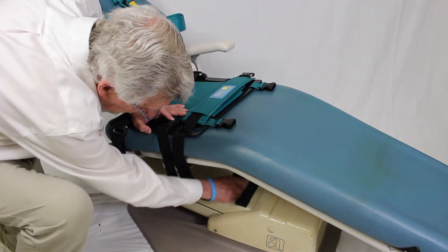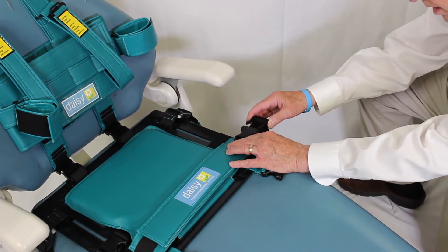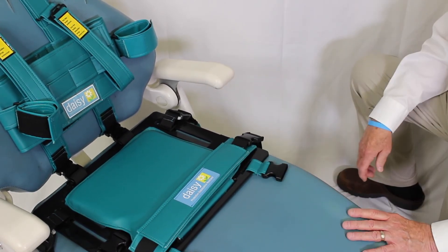Then thread the thigh strap under the dental chair to the original side. Attach this strap to the buckle. You do not need to tighten this strap until the patient is positioned in the seat.